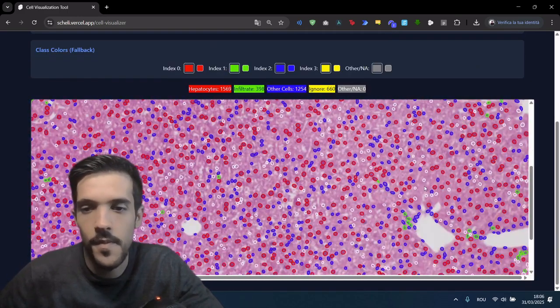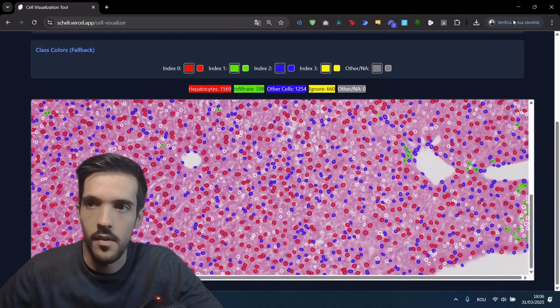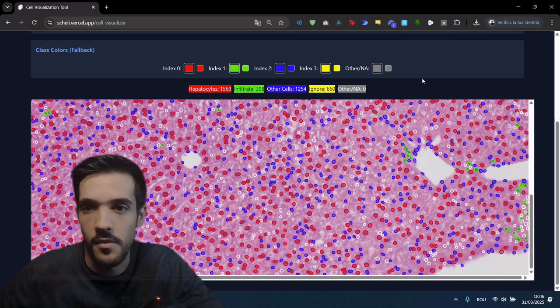And this is it. You can then use all of this information for whatever statistical analysis.